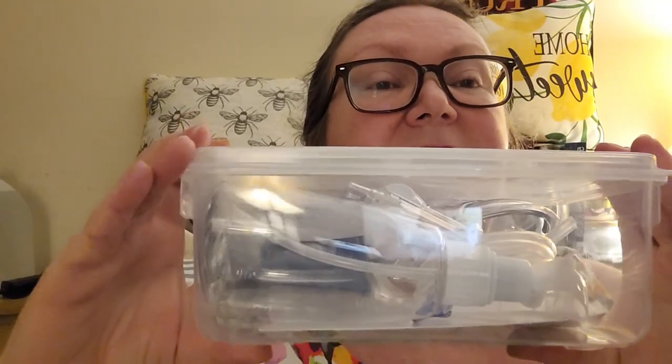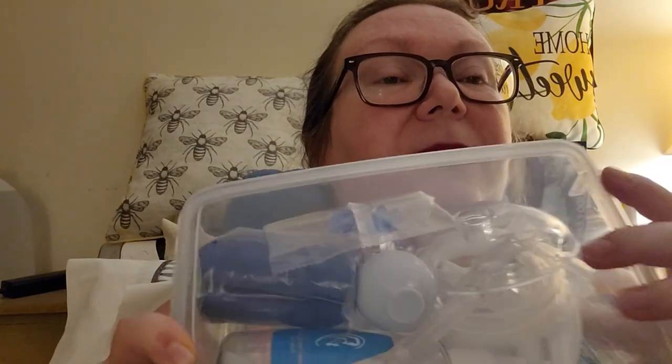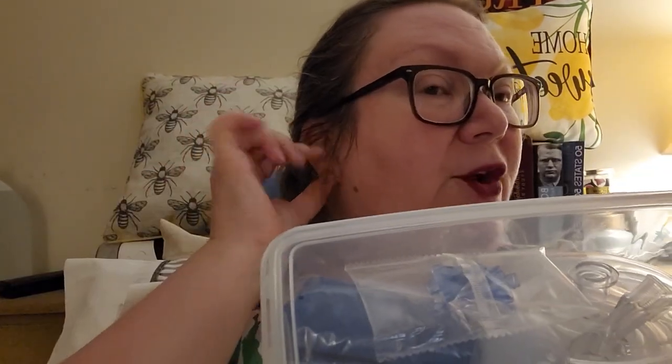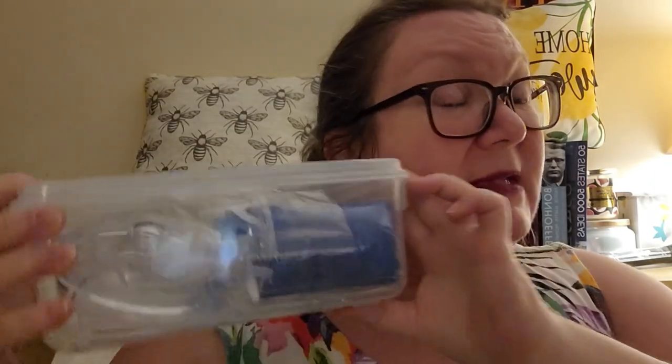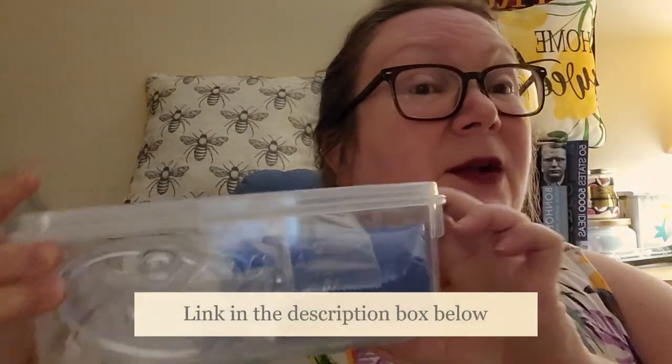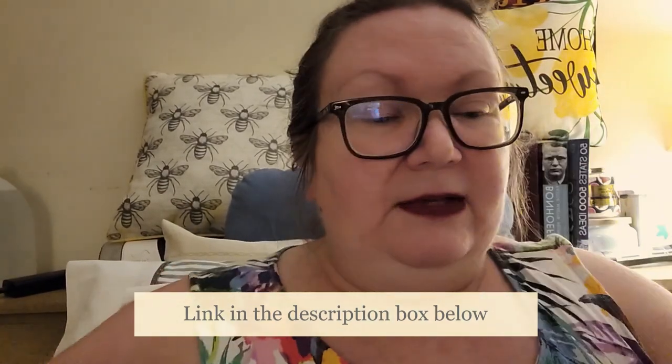They used an irrigation system. Let me show you — I just took this out of the box and this is what it looks like. It's got a bottle. It comes with a cup that fits over your ear with a tube going in it. And it comes with a little box that you can keep all your tools in, so it's easy to stash away between uses. I love that.